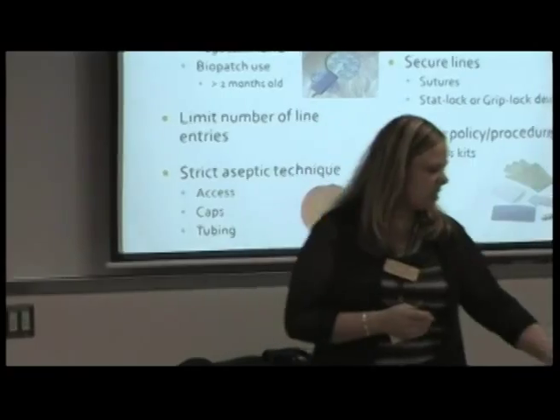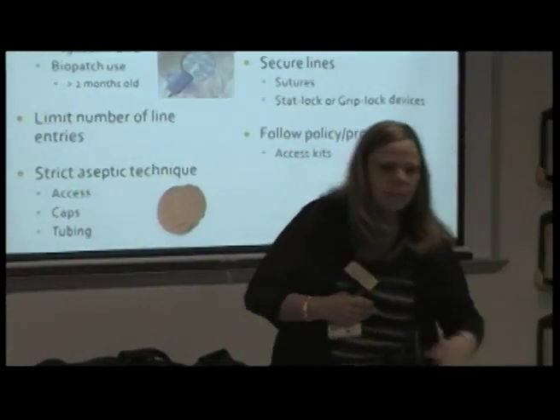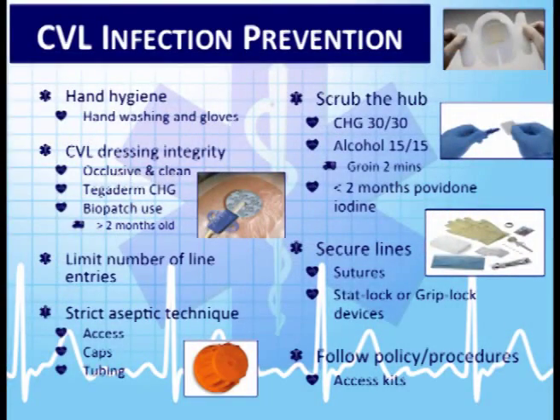Either way, just make sure it's nice and secure with either the stat lock, grip lock, or whatever they're using. The tubing is a big thing in the ambulance. Lots going on sometimes there.